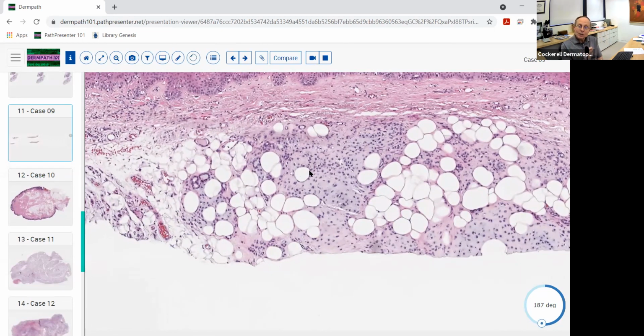Now, that's a relatively rare phenomenon, and it's actually been called also a mesenchymoma, if you will, where you've got multiple different types of mesenchyme that are forming a tumor. So fat is mesenchymal, chondroid is mesenchymal. Could this have come from a myxoid lipoma that underwent chondroid differentiation?